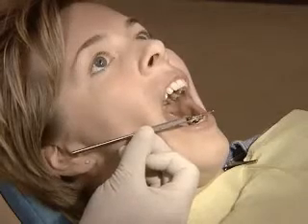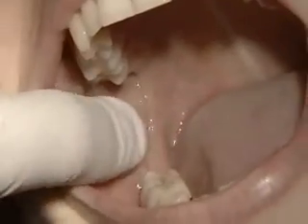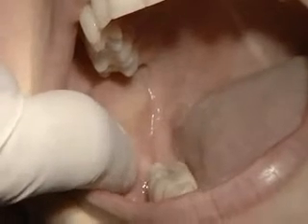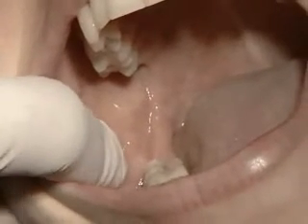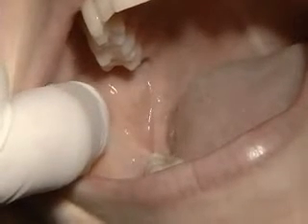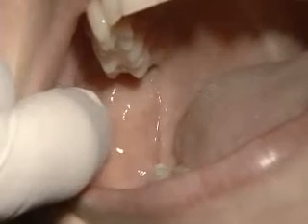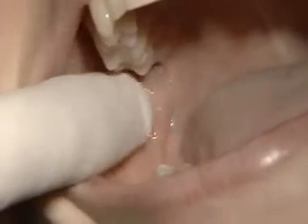Once the angle is determined, you are then able to begin the injection by palpating your intraoral landmarks. And as with all three techniques, you start off by feeling the anterior border of the ramus. My finger is now in the coronoid notch and external oblique ridge, and I move it upwards superiorly until I feel the coronoid process. And at this point, I can feel the insertion of the temporalis muscle.